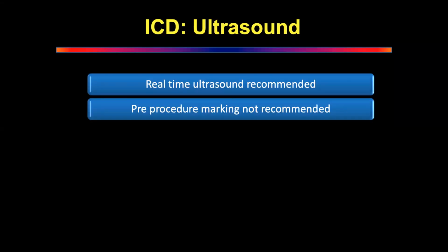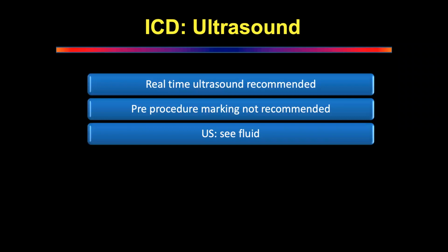Should you actually mark it in the radiology room, put a mark and come and do the procedure? The alcohol will rub off the marker. And what else? The position may change. The fluid collection may not be the same, because they might have done the mark in lying position, and you will do it in sitting position. That will change. So pre-marking is not recommended.